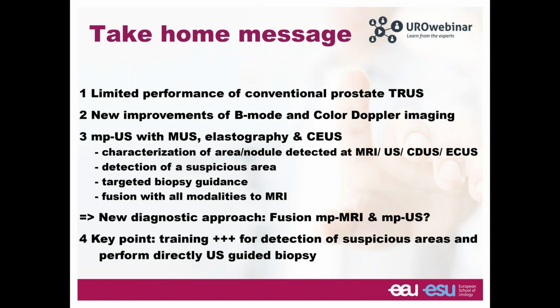Probably, maybe the future will be a new diagnostic approach, which could be the fusion of the multiparametric MRI and multiparametric ultrasound volumes, not anymore slices, but volumes. But the key point remains training again for the detection of the suspicious areas and to be able to perform directly ultrasound-guided biopsy.